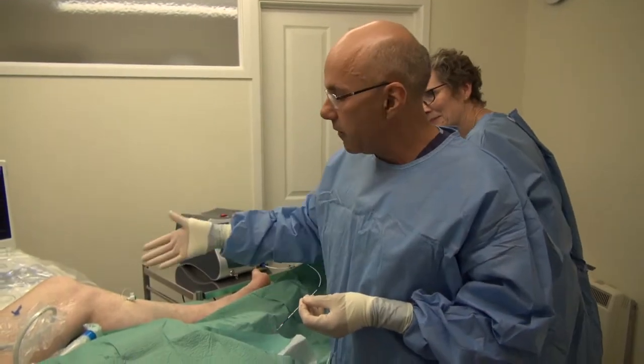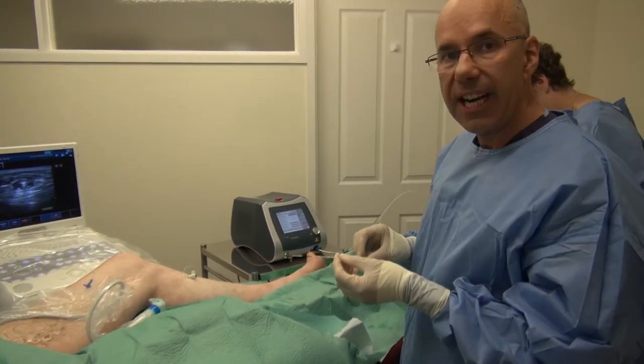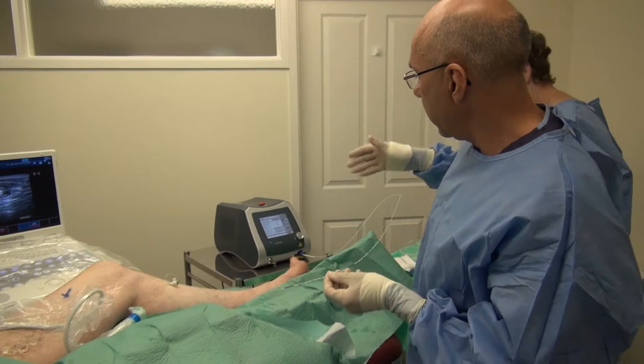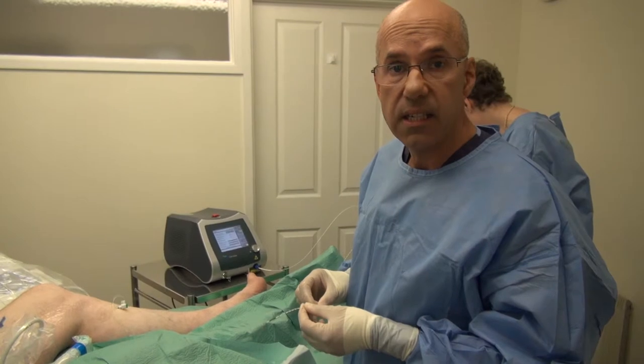We're at the stage of the procedure now where the vein is cannulated and we're about to introduce the laser fibre. Here at this clinic — the VeinCare Centre at the Melbury Clinic — we use the BioLitec system.